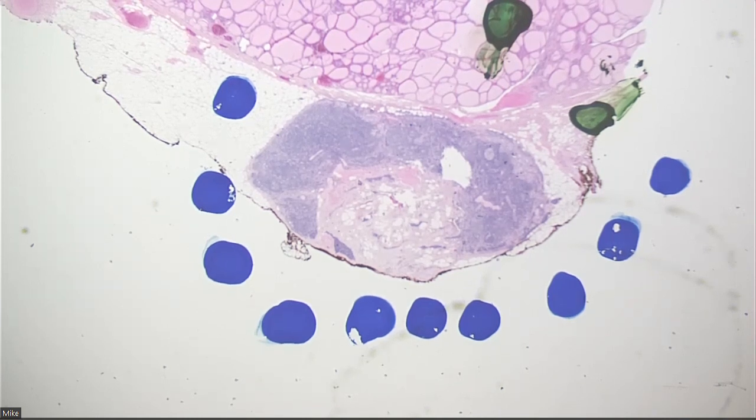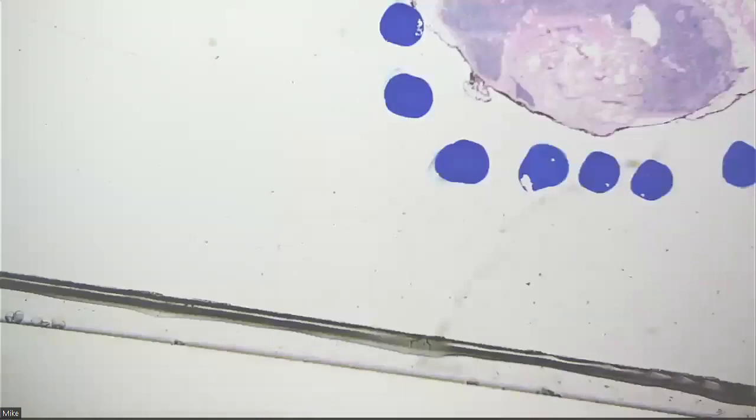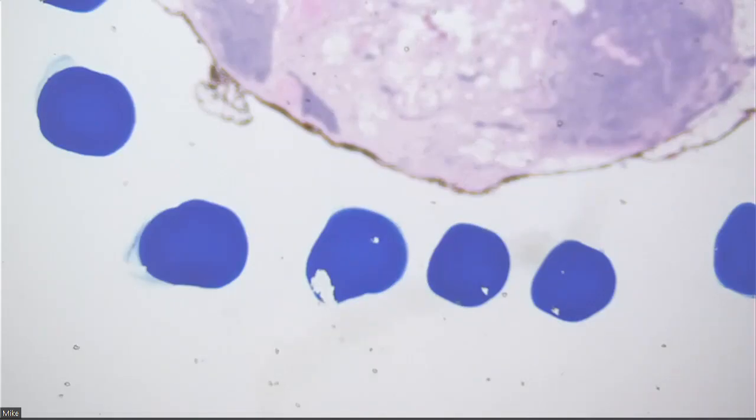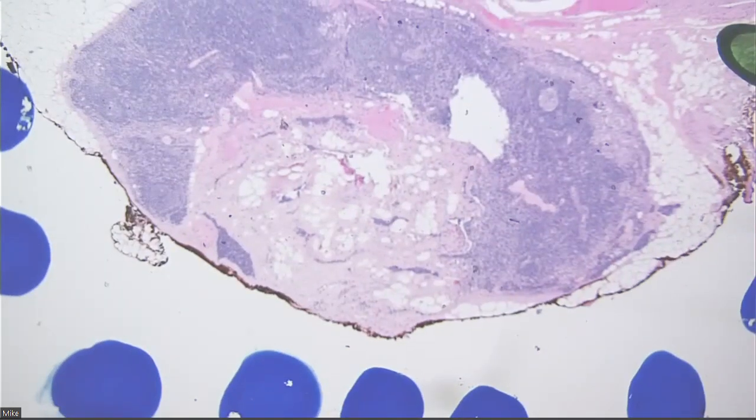I have a question. You mentioned the size of the lymph node that matters. In this case, when they kind of look discontinuous, how do you measure it? So I usually measure the whole span, because you don't necessarily know that they don't connect somewhere. So I would measure the entire span in this node. Okay.